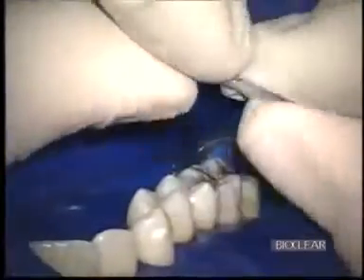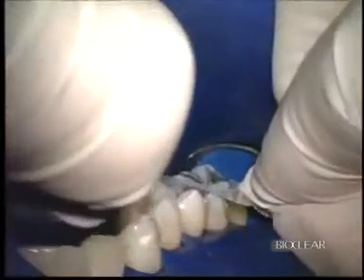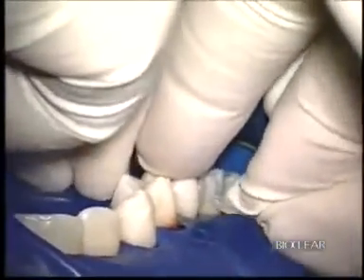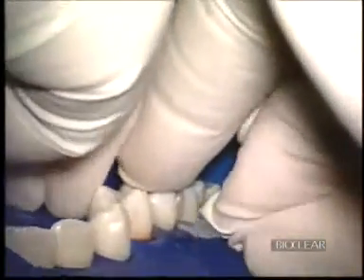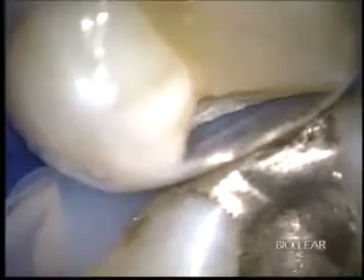Now I am placing a thin interproximator. For bicuspids and anteriorly, you can hold onto the handles of the interproximator with your fingers. In more posterior applications, such as for molars, you'll want to use the little microhemostats, or cotton pliers, to grab the ends of the interproximator. Notice the unique adaptation of the anatomic Bioclear matrix combined with the delicate pressure of the interproximator.